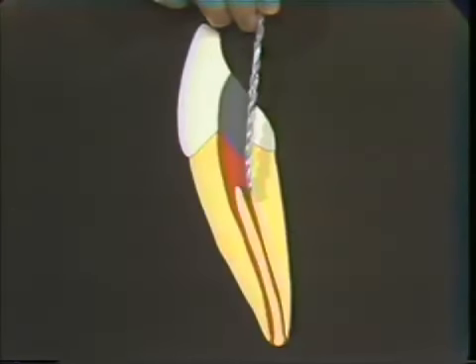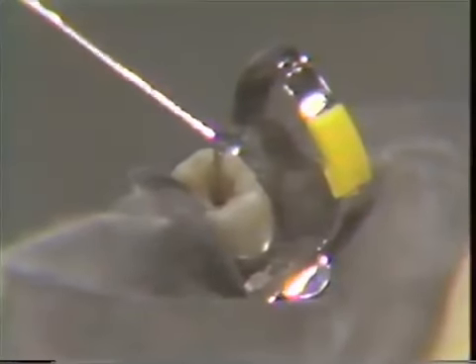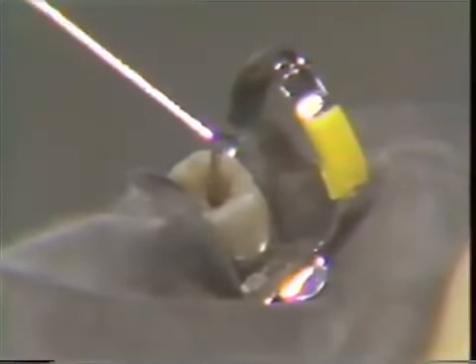The maxillary bicuspids, once again, are usually no problem to students. Well, the first bicuspid usually has 2 canals. The second maxillary bicuspid usually has 1 canal, but either one could be reversed. You have to check both teeth for 2 canals. You do that by, once again, coming in from the buccal and looking for a canal going off to the lingual, then coming up, changing the direction of your explorer, coming down, and feeling for a canal on the buccal.